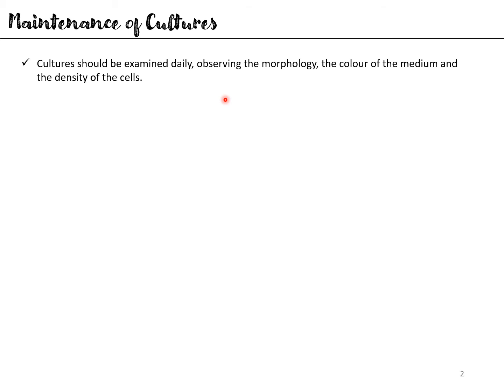If the adherent surface is around 90% confluent, then there would be no further space for the cells to grow. Because adherent cells require a flat surface to grow on, they would tend to grow on top of the other layer, so they will not be growing as a monolayer, and this would cause the cells to simply peel off from the surface to which they were adhered.